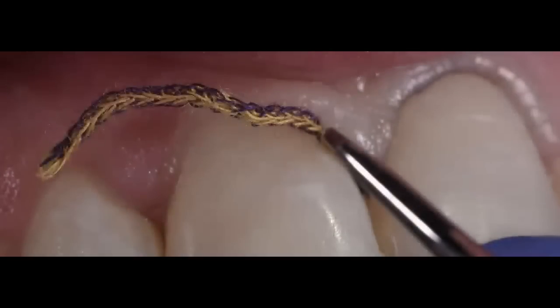So the first thing that I would recommend for isolation purposes is that you go about retracting the tissue. If you place a cord, and I normally use a 00 cord from Ultradent, you know that you're going to retract the tissue, and that is going to displace the tissue so that you have more enamel available for you to etch and bond to.